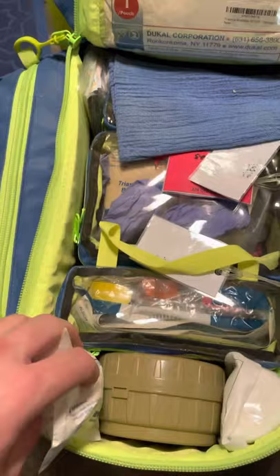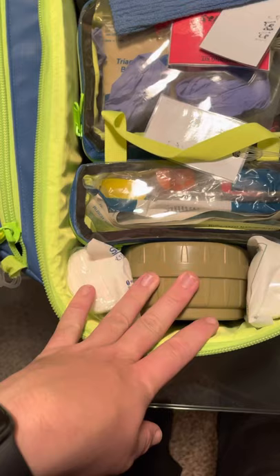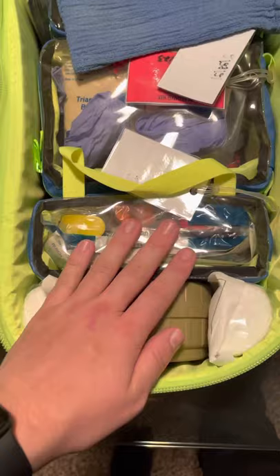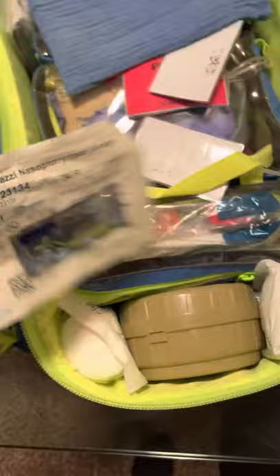Here's my BVM — it is a Cyclone pocket BVM. I highly recommend these over traditional BVMs because they take up much less space, but still function as a one-liter bag. This section here is my OPAs and NPAs. One thing I like to do with my NPAs is make sure they all have lubrication jelly already attached and taped on, so that's one less thing I have to dig out. I also have all my NPAs organized by size, smallest to largest, which helps me identify the right size more easily.